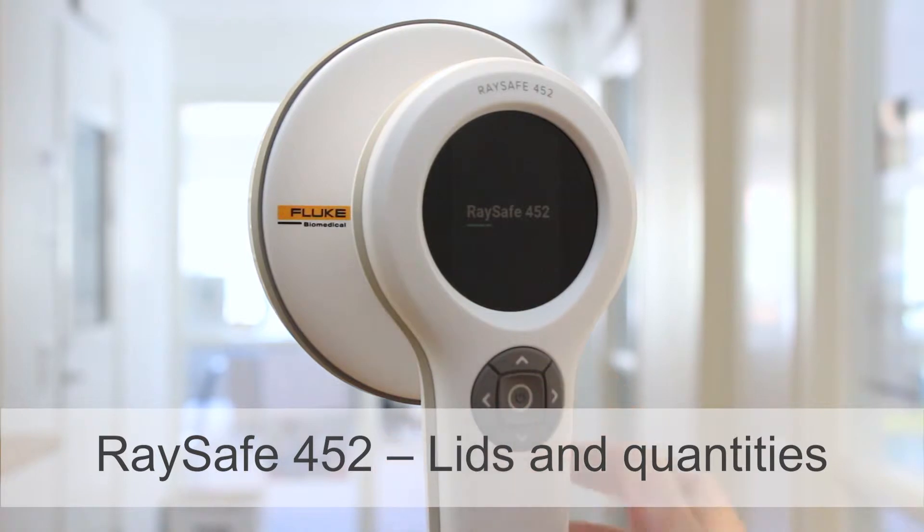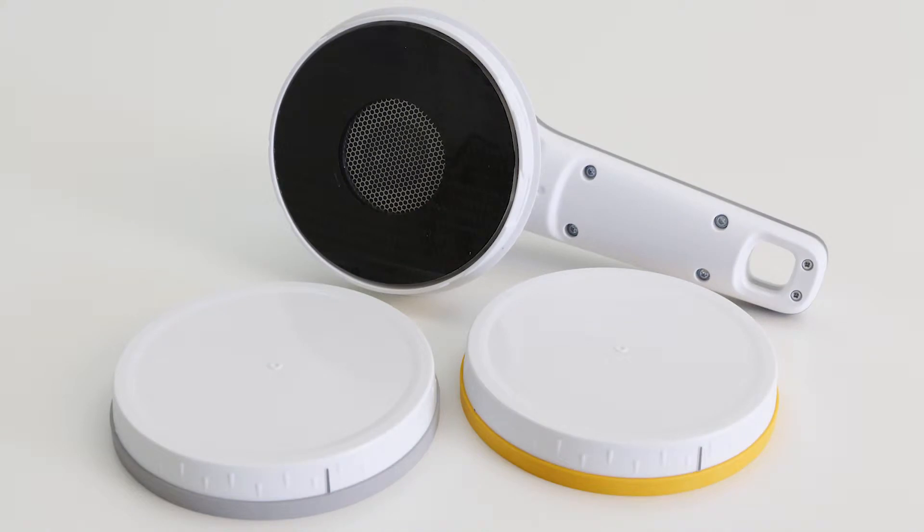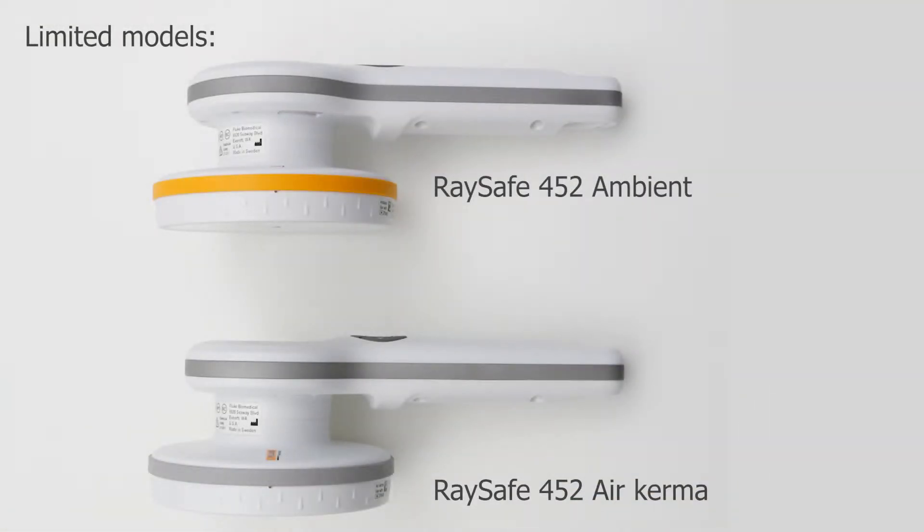In this video I'll show you the lids and the measurement quantities of the Raysafe 452. The Raysafe 452 comes with two lids: the AirKerma lid is grey and the ambient lid is yellow. Just a note before we start — the limited models called Raysafe 452 Ambient and Raysafe 452 AirKerma can only measure with the lid mounted.